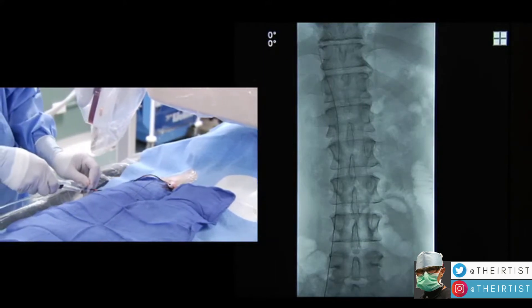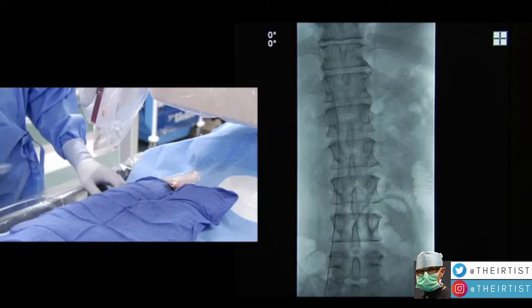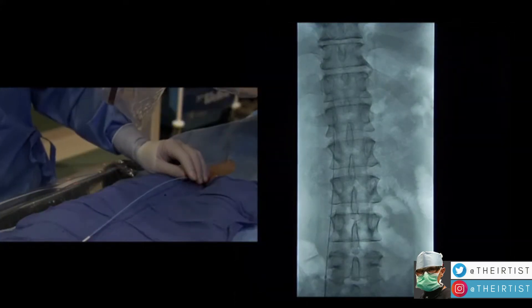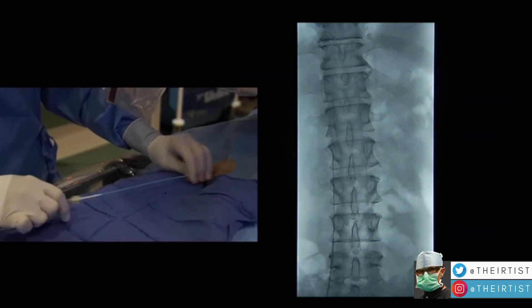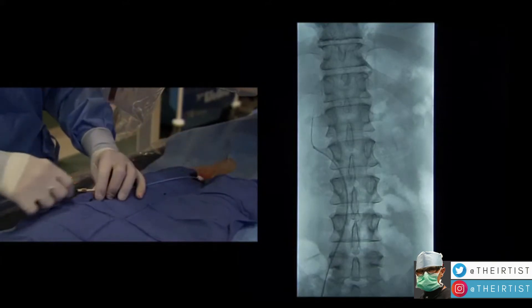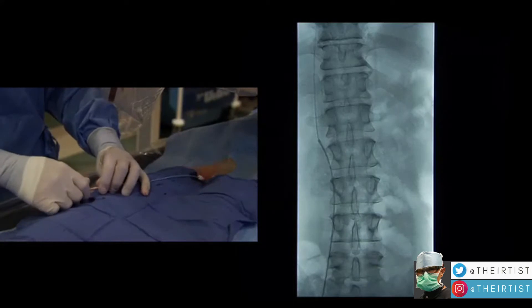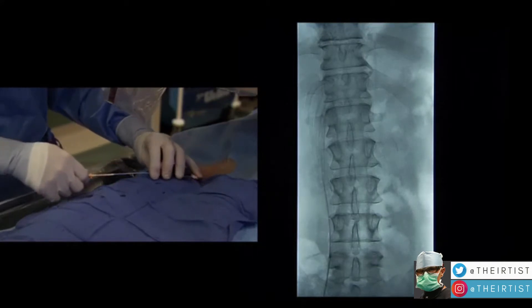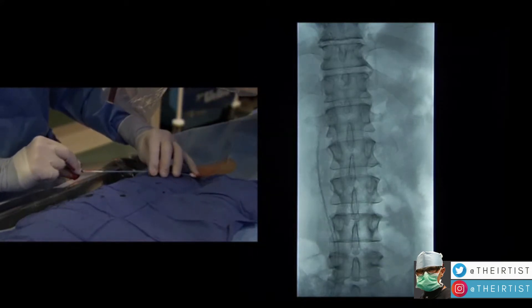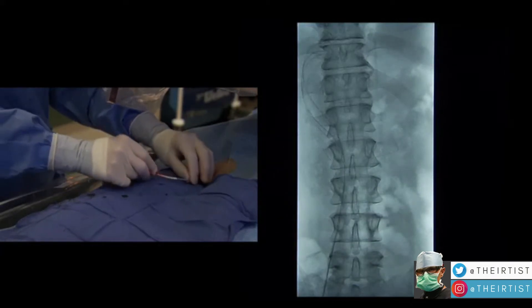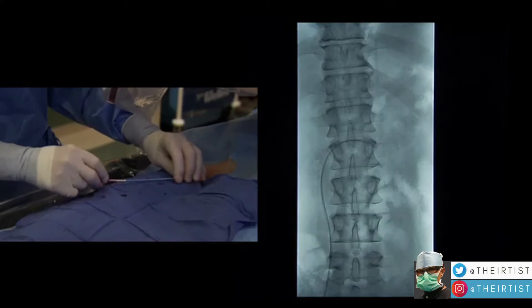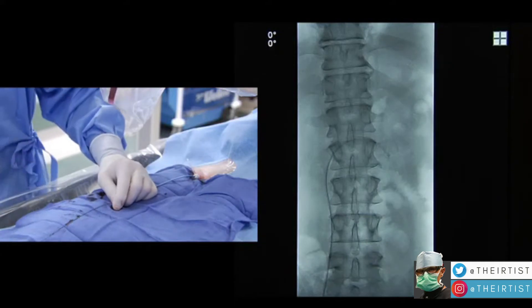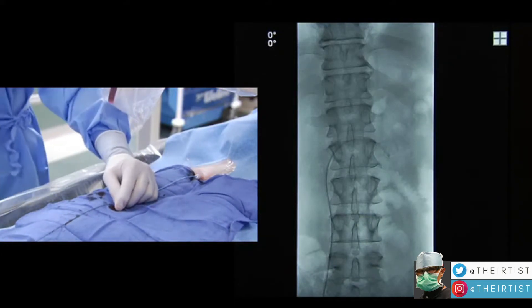The physician places what we call a vascular sheath, which is flushed. After that, a guiding catheter with a special gonadal shape is introduced. This shape allows the physician to quickly maneuver the catheter, seeing what is happening inside thanks to the X-rays. The shape of this catheter quickly finds the renal vein and gets into the spermatic vein that originates from the left renal vein.